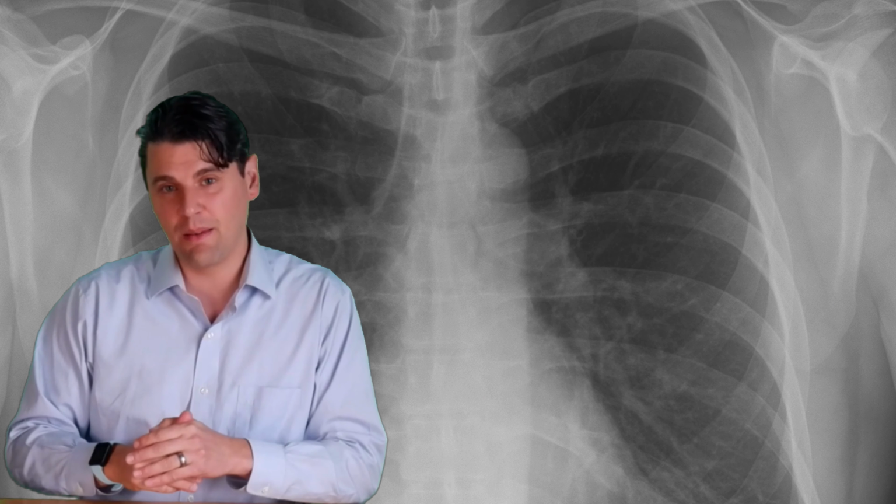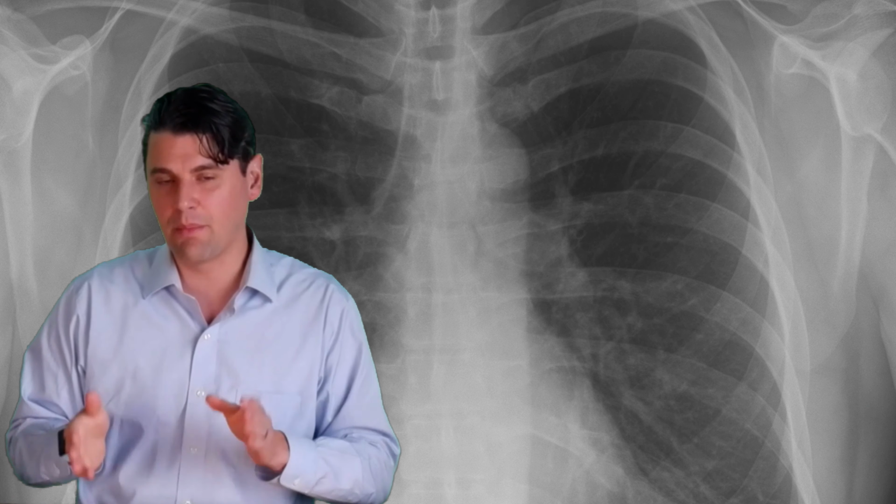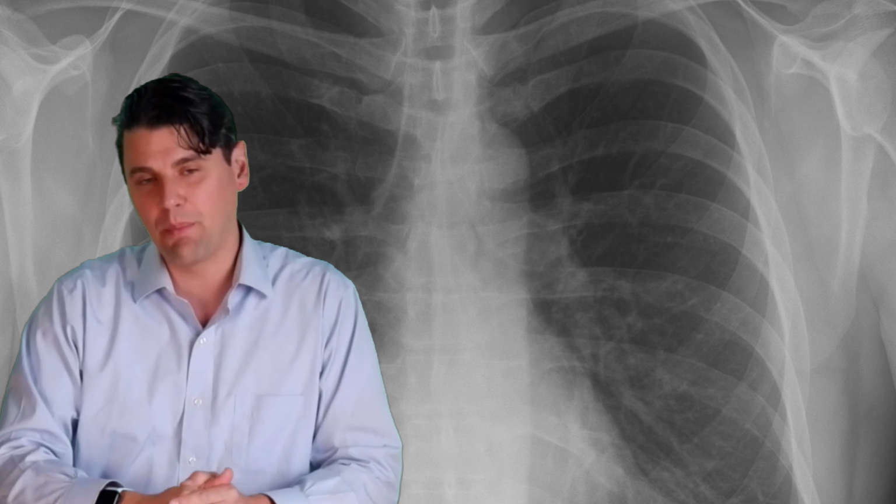There's also some modern scanners using that two-tube, two-detector technology. If the patient's heart rate is relatively stable, and you can predict ahead of time where you want to gate the image, you could use a fast, high-pitch acquisition in order to cover the whole heart. In that case, you're going to have a varying phase throughout the heart, but it does allow you to cover the whole heart without that dose penalty of the low pitch helical scan.